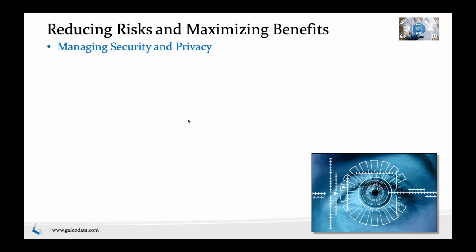The first step you generally do is a risk assessment. That's how we do medical device software or medical device development in general: we start with the risk and figure out what harm a particular technology, device, or software can bring to the user. We similarly do a risk assessment for the cybersecurity aspect. Step one is generally what we call threat modeling.